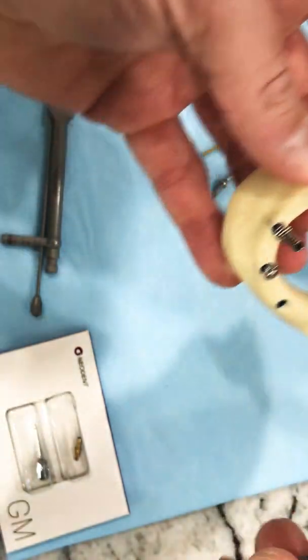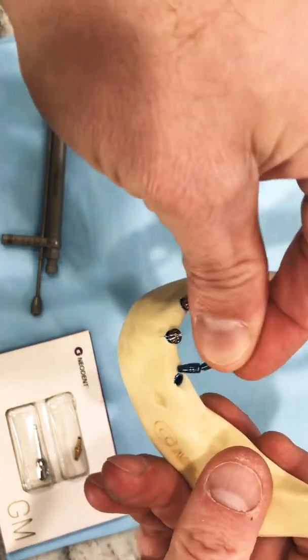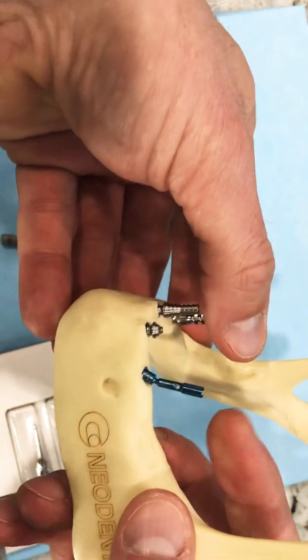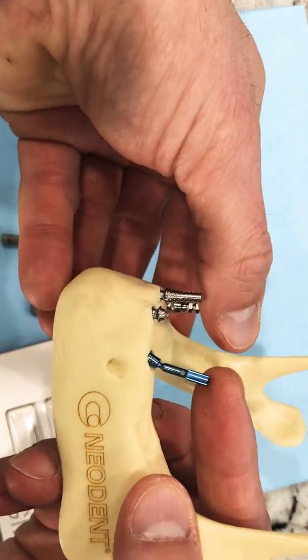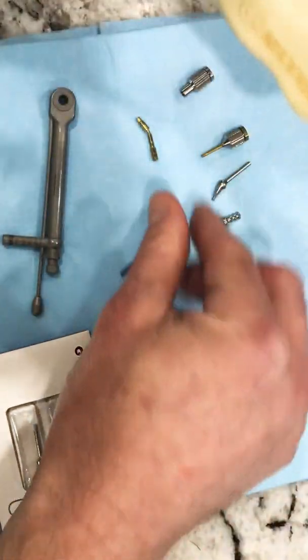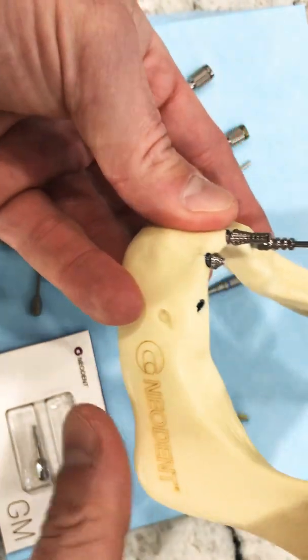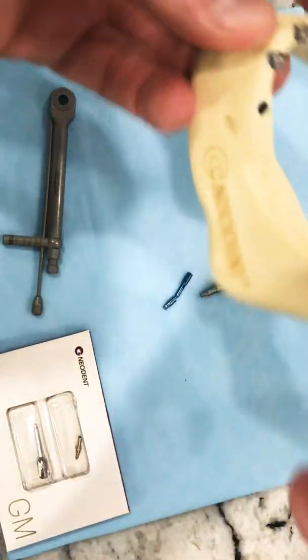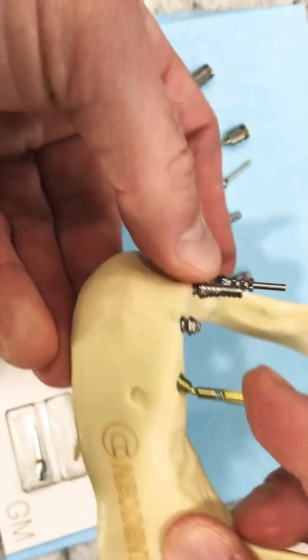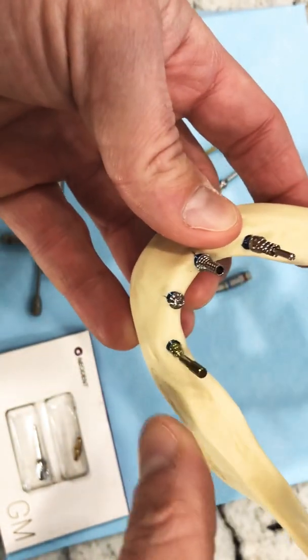That helps to put our 17 or 30 degree angled abutment onto the implant and get everything as close to parallel as possible when we're placing our temp cylinders. So if I had the 17 degree peg and place that in — that looks pretty good, except it still angles our abutment a little bit distal. Maybe I can check that one more time with a 30 degree angled. Now I like that. I lock it down into the hex and I see that I'm darn near parallelism with these others for an easier path of draw on my prosthesis.